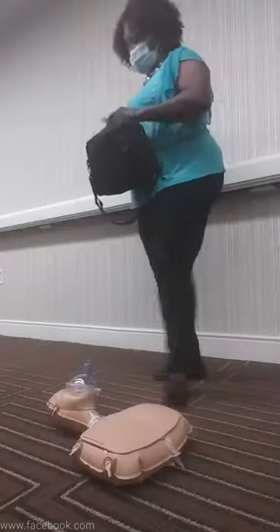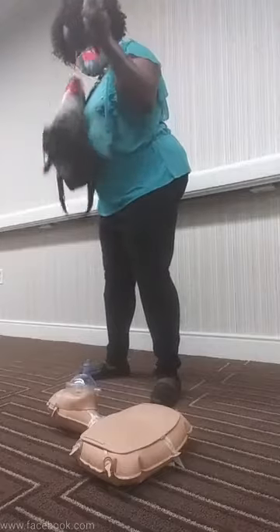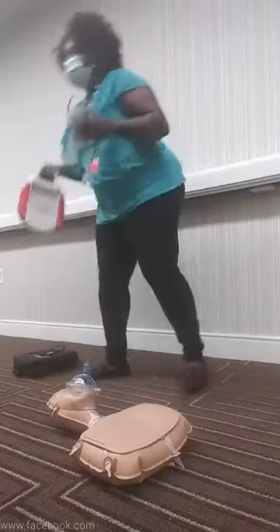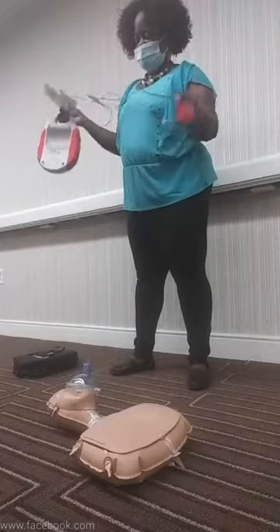Do not delay using an AED. There are some AEDs that turn on automatically, and some you have to physically turn on.